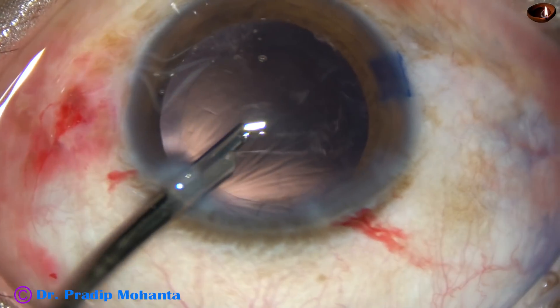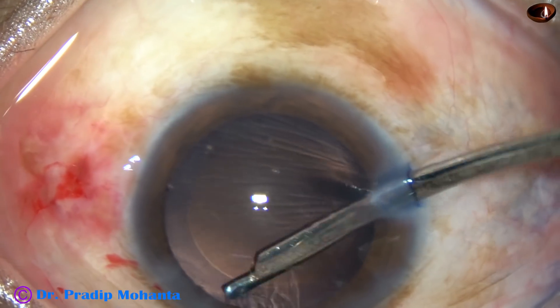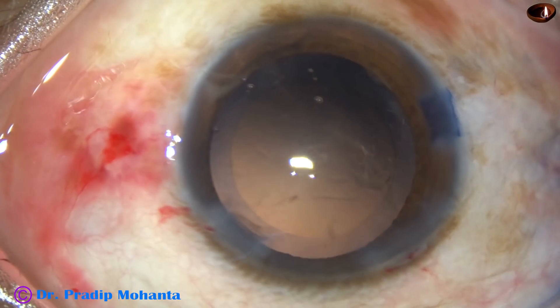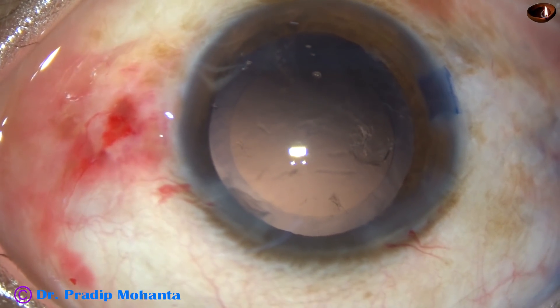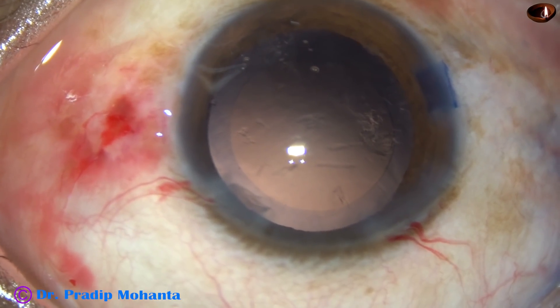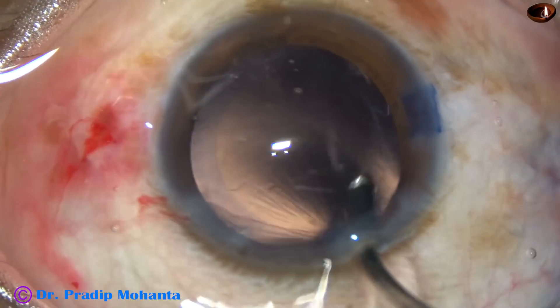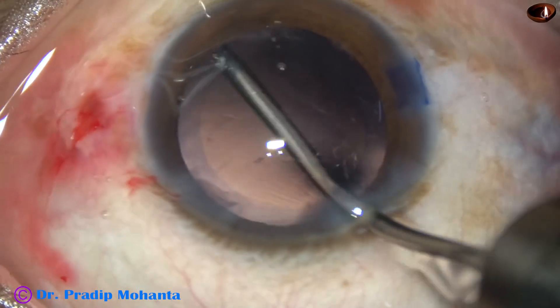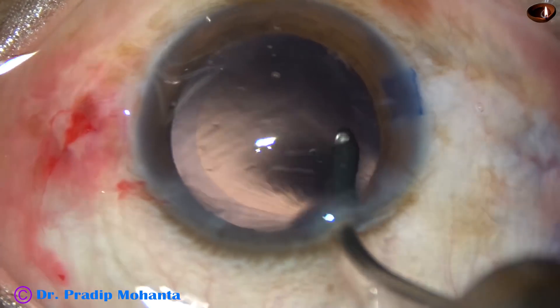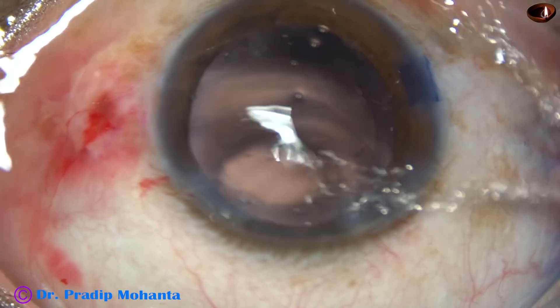The side ports are a little larger — about 1.6 millimeters — and a 23G Simcoe goes through these side ports easily. And now, this is hydro polish: only the irrigating fluid jet is being directed towards the posterior capsule by just slanting the probe. I use only the irrigating fluid to dislodge the cells from the posterior capsule, and I call it hydro polish.